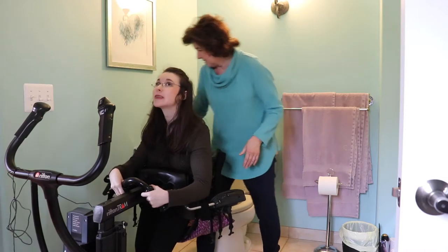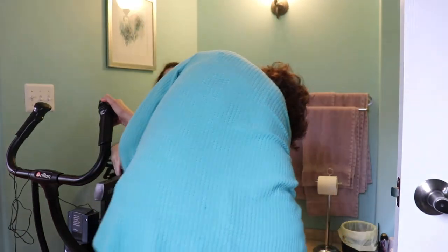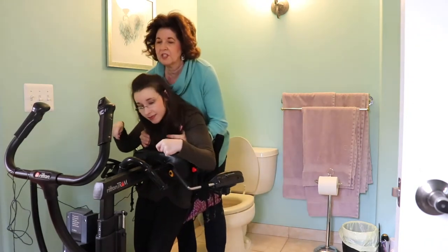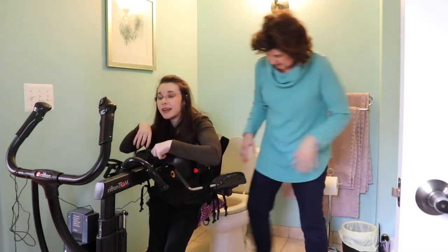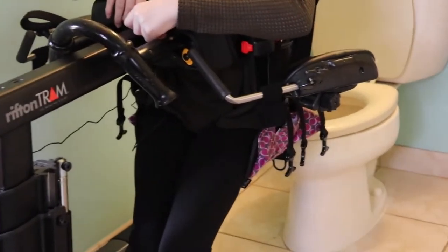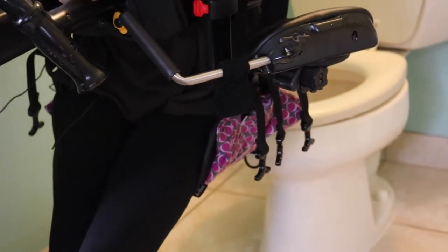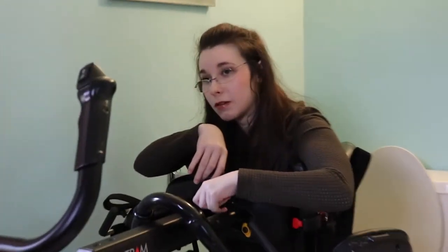And then there's a... hold on mom. I'll scoot you back a little bit. One. Two. I just want to put it a little higher. In this case I lift her and scoot her back, and she sits — yeah, I sit like so. I'm going to zoom in on the sling part. She sits on those — I sewed them together to make a sling, and we used three of them. I was hoping one would go more under her legs, but they always seem to go under her bottom instead.